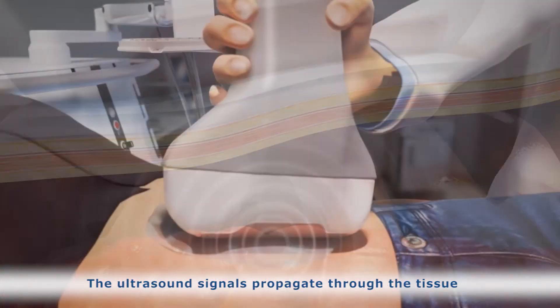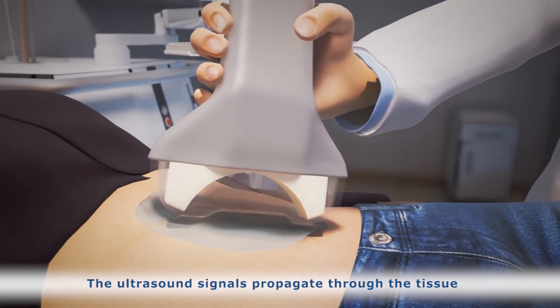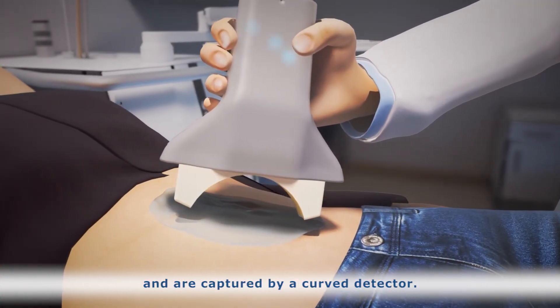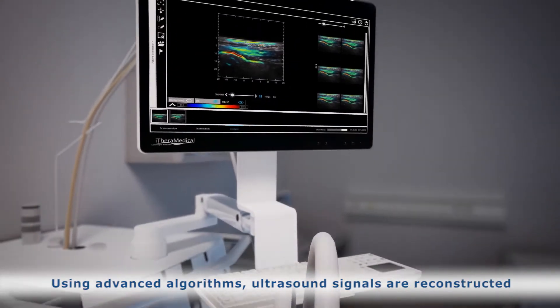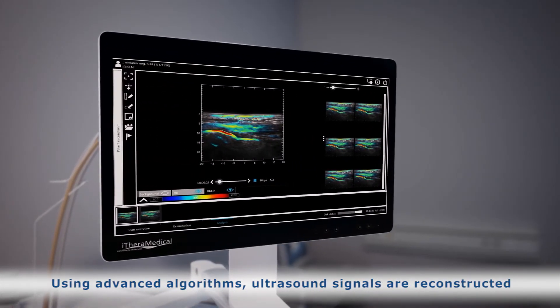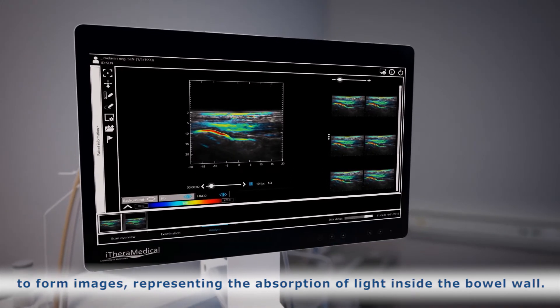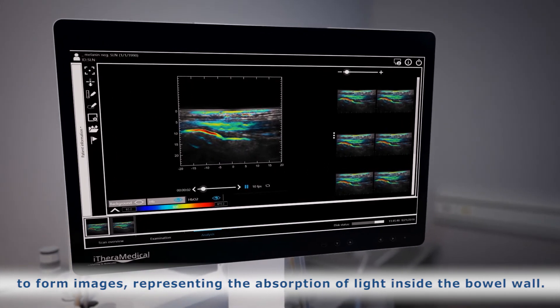The ultrasound signals propagate through the tissue and are captured by a curved detector. Using advanced algorithms, ultrasound signals are reconstructed to form images, representing the absorption of light inside the bowel wall.